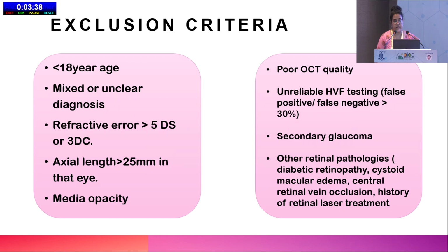The exclusion criteria are patients less than 18 years of age, mixed or unclear diagnosis, high refractive error or axial length, any media opacity leading to poor quality of OCT, unreliable HVF testing, secondary glaucoma or any other retinal pathologies like diabetic retinopathy or retinal laser treatment.